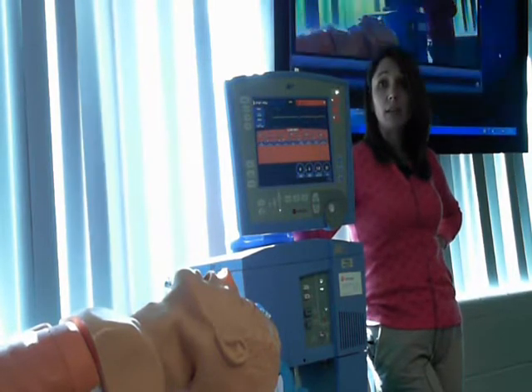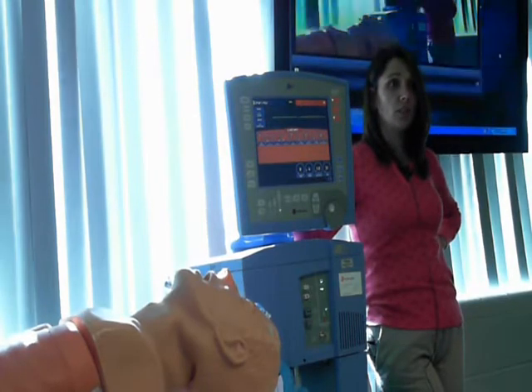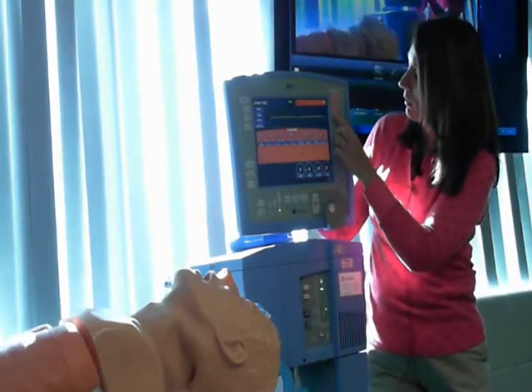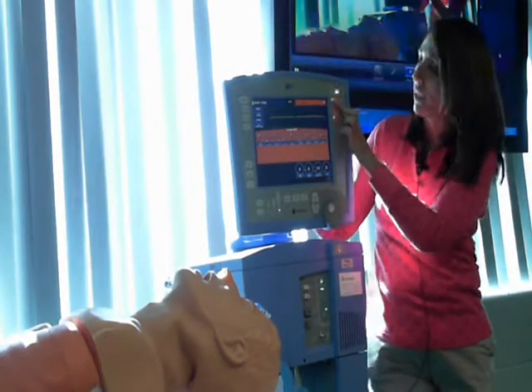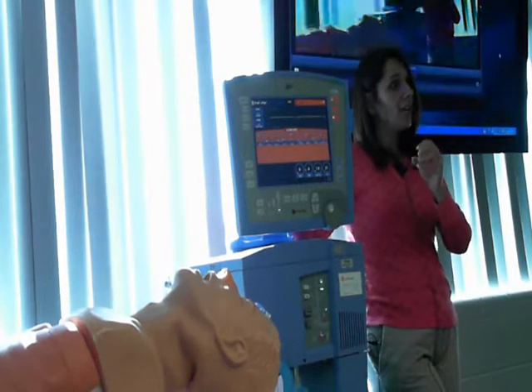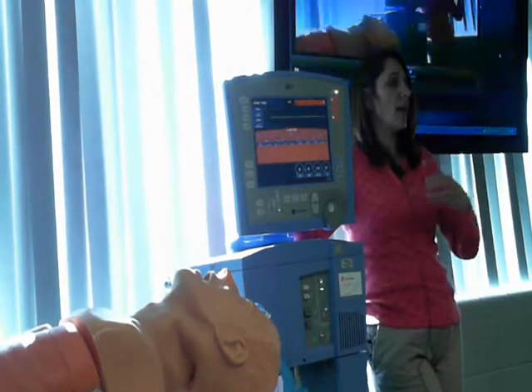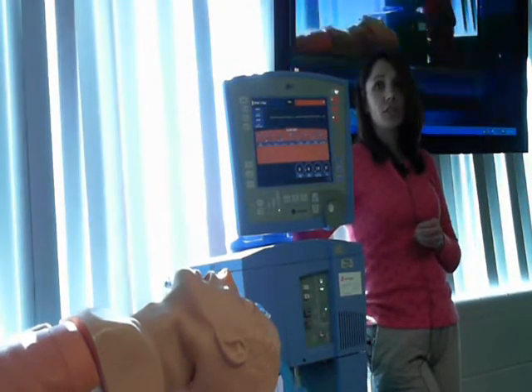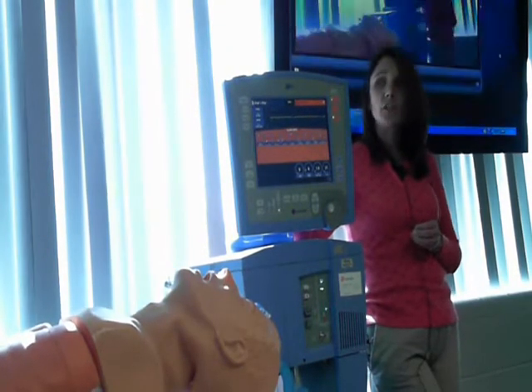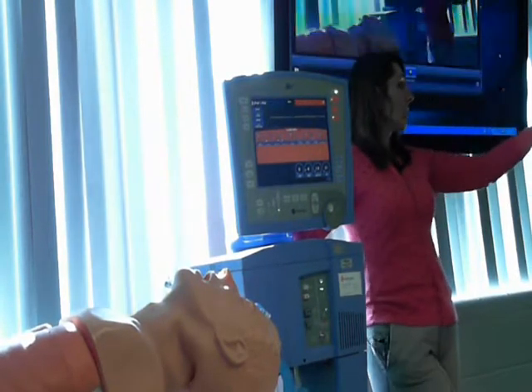Because it's now telling you, hey, this patient's not breathing anymore. They probably need your attention. So I don't want you to think that they will go completely apneic and not receive any ventilation. But I do want you to know that if you see that apnea ventilation alarm, and all of the vents have it, that patient needs your attention, and they need it quickly. Okay? Questions so far over the modes? Some of the indications? Yes.